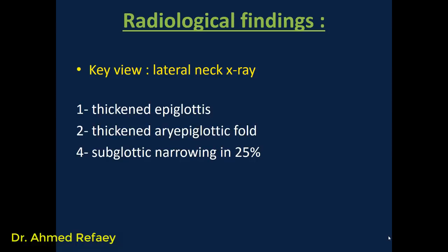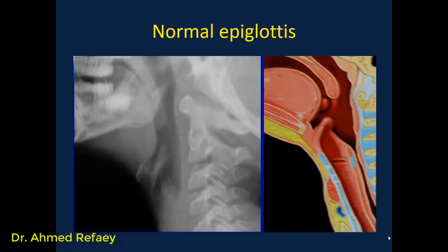In croup, there is 100% subglottic narrowing. This is a normal epiglottis — look at this color image showing normal anatomy. Here is the soft palate, the uvula, and the tongue. This is the nasopharynx, oropharynx, and hypopharynx. This is the epiglottis, and this one is the aryepiglottic fold. On lateral neck X-ray, here is the epiglottis and here is the aryepiglottic fold.